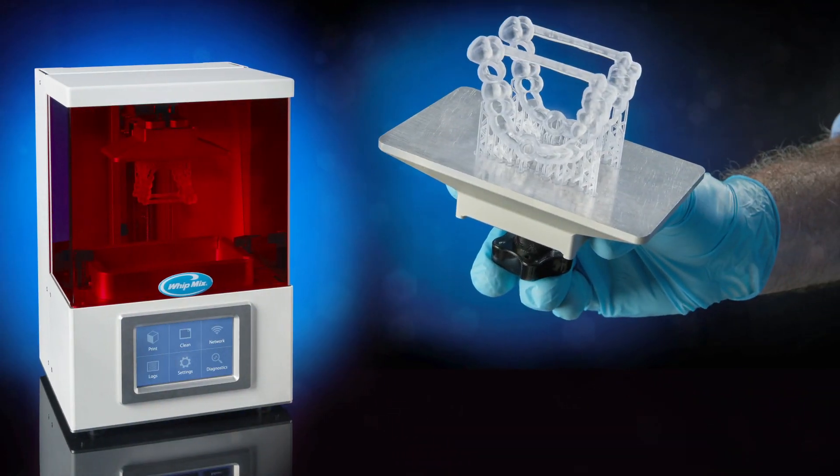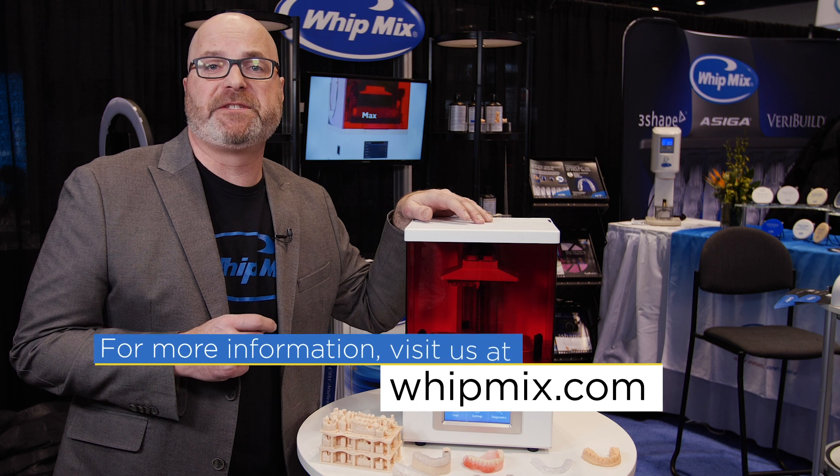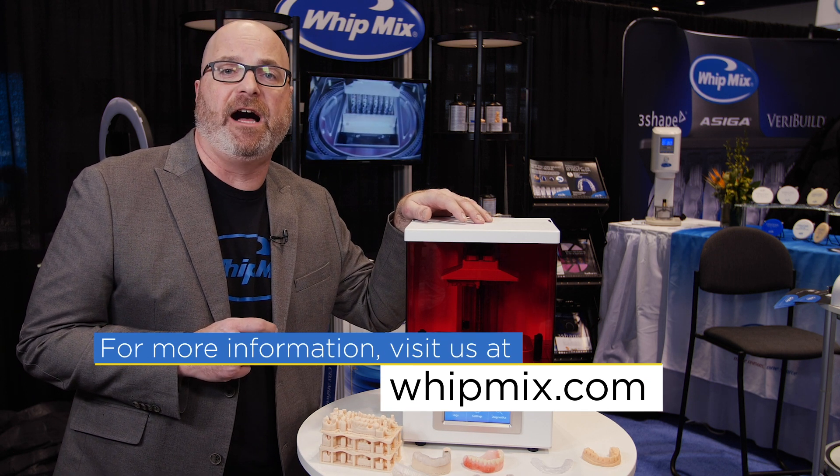So there's currently model material, surgical guide, denture, and temporary material available for this printer. If you would like more information, you can find that on our website at whipmix.com.